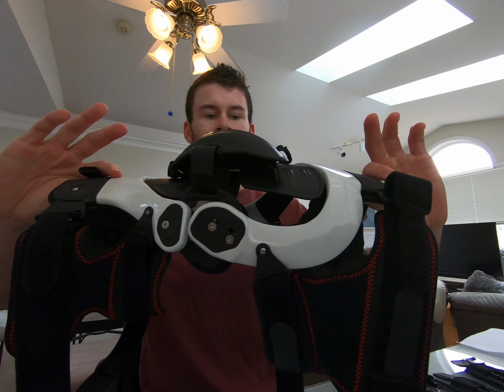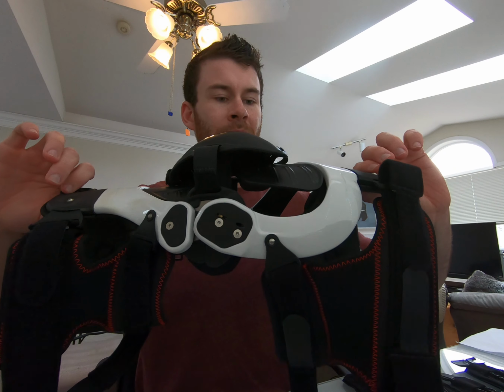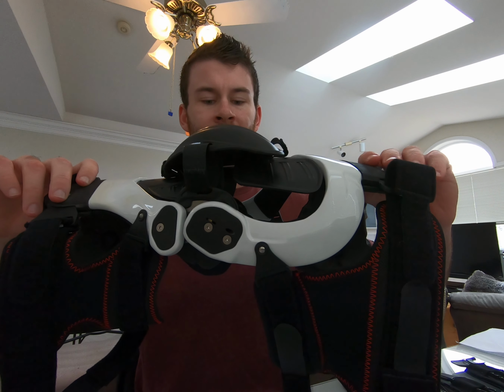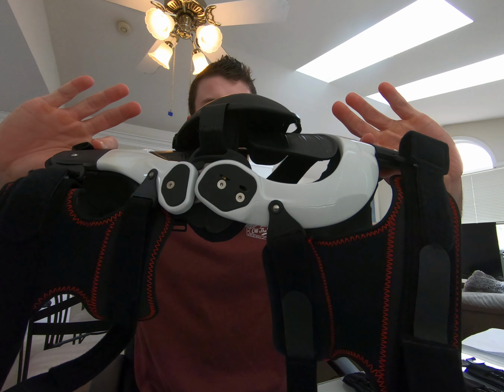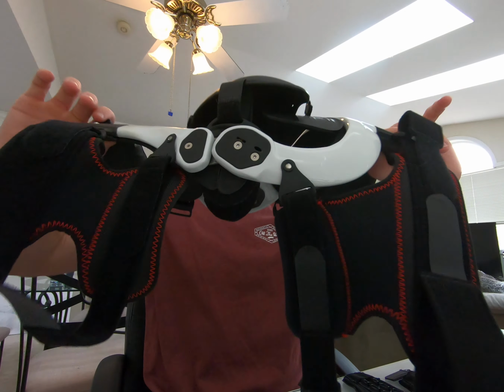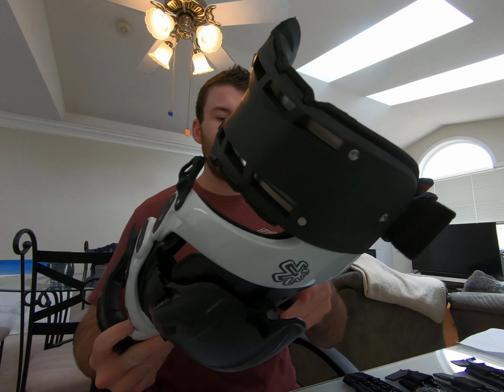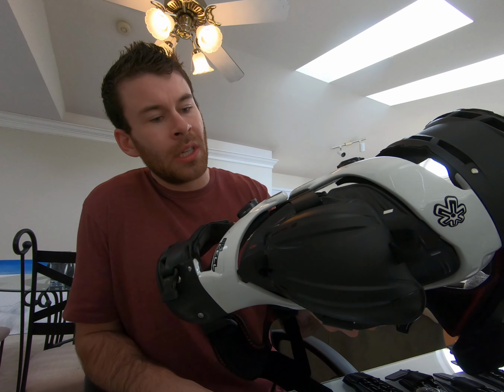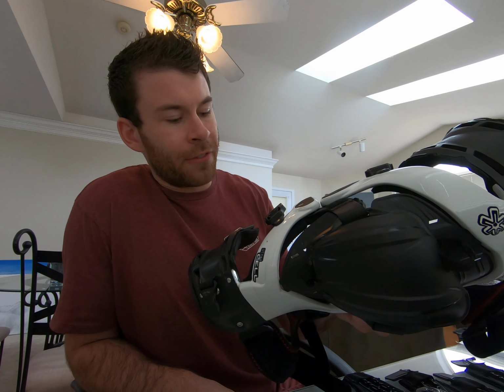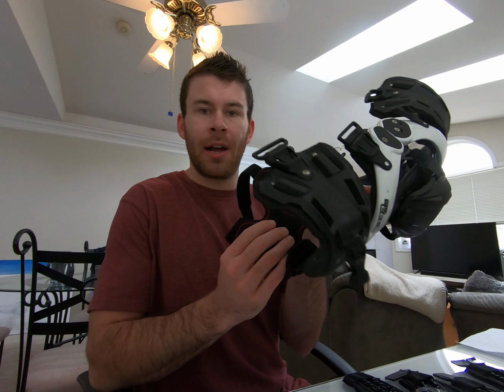So these things are pretty robust. You can adjust the lockout angle. My right knee's pretty bad, but it's not hyperextension I'm too worried about. It's more side-to-side torque, so I have mine set pretty flat. It's probably between 0 and, I don't know, 0 and 5 degrees or something on lockout. So overall, it's a good product. I wish I wouldn't have bought one of the first generations. I would have waited a little bit to get the strap system.